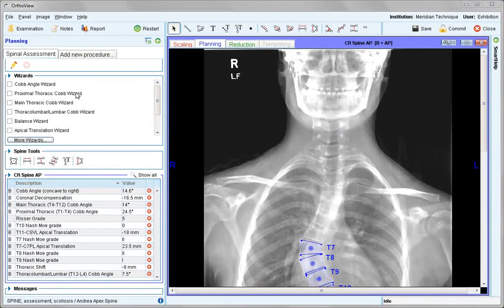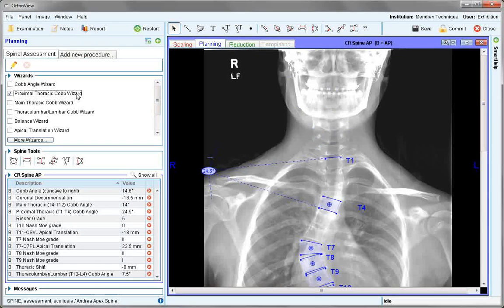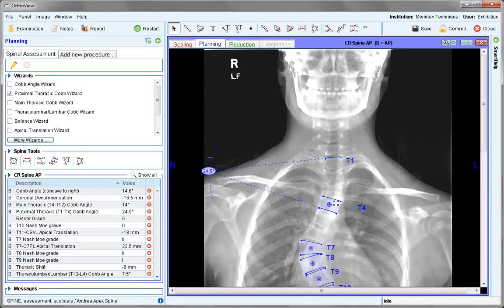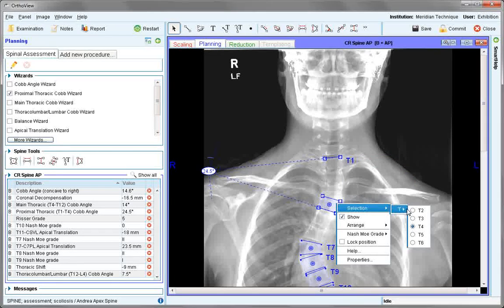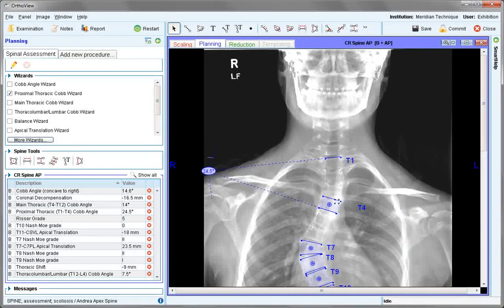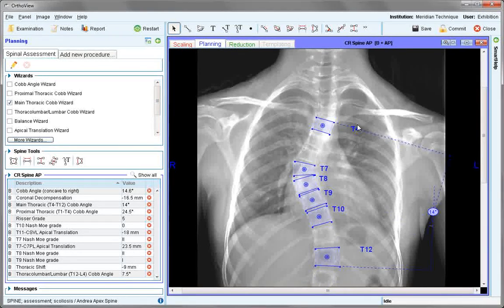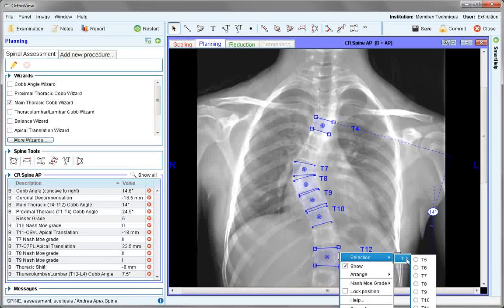The proximal thoracic Cobb is one of a set of three which identify specific points of curvature in the spine and they have a limited positional range — for example, from T1 to T3 and the lower section T2 to T6 depending on the curvature shown. It's important to identify the vertebra as other references are made from this area. Moving down to main thoracic, scrolling the image, its position is between T4 and T12. Right click to identify and select the vertebra of interest.